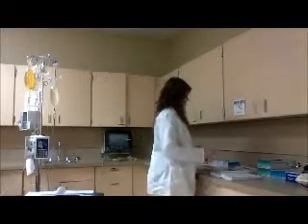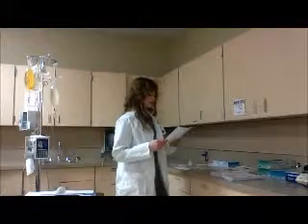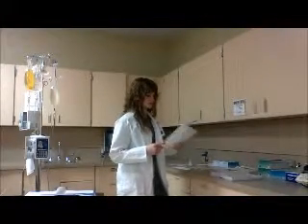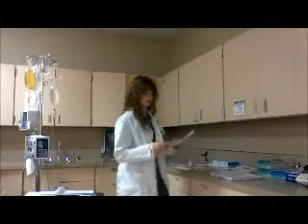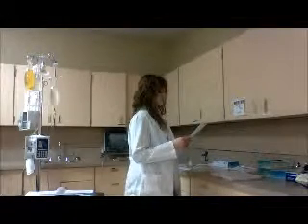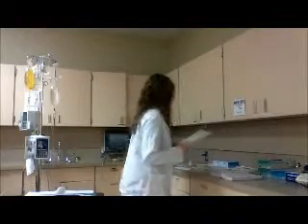So I just got in an order for my patient. He's a 16-year-old male, been diagnosed with acute pulmonary emboli. The physician ordered 75 units per kilogram of heparin, a loading dose, so that's a bolus, and then to follow with a heparin drip of 20 units per kilogram per hour.